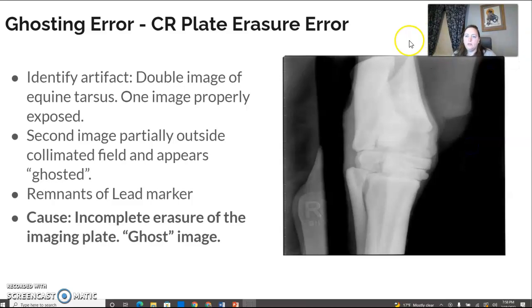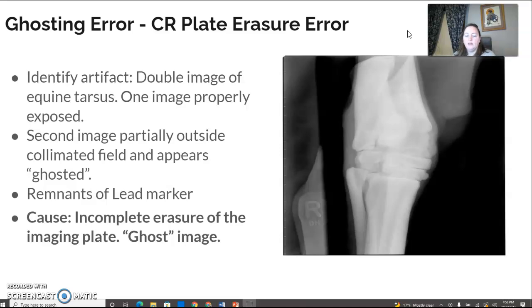One of the main ones would be the ghosting error or the ghost image that you might find on CR. That is an error with the erasing. As we know from our previous video, the CR plate is erased using a bright white light. Here you can see we call it a double image.